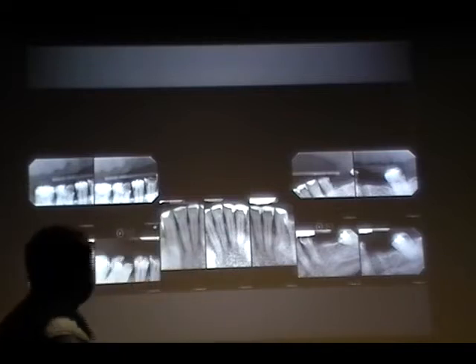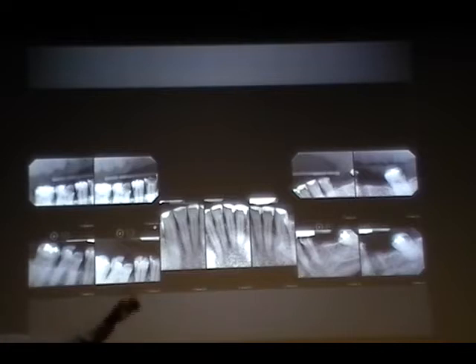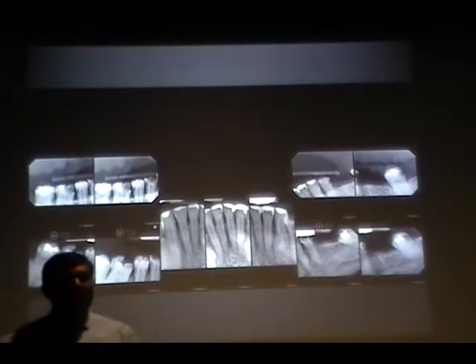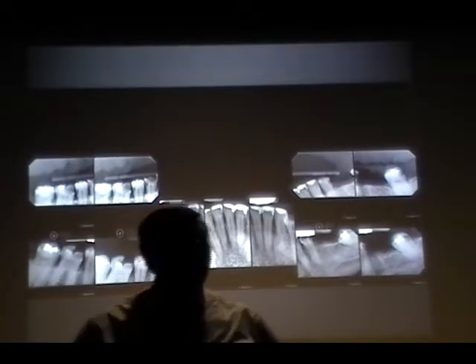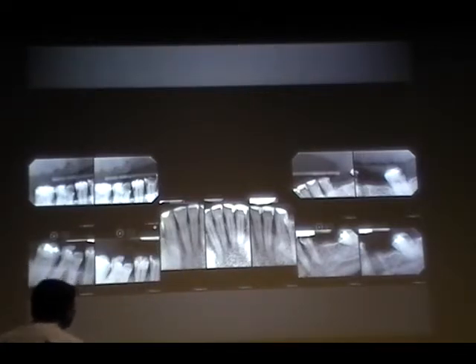How about this one? There's no apex. Okay. How do you rectify this? We readjust the sensor. How do you adjust the sensor? Pull it a bit more down to cover all the tooth structure. Okay. How about this one?